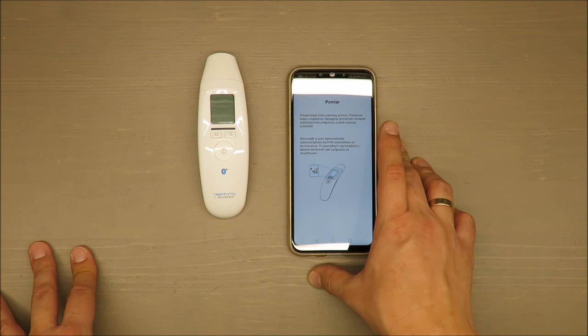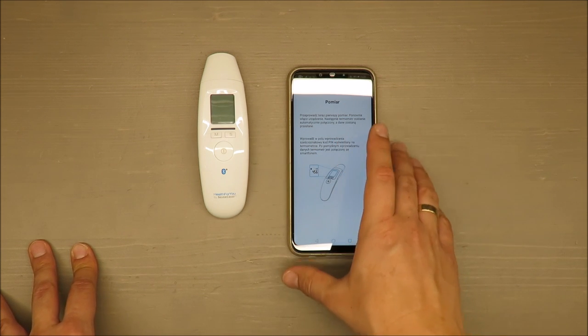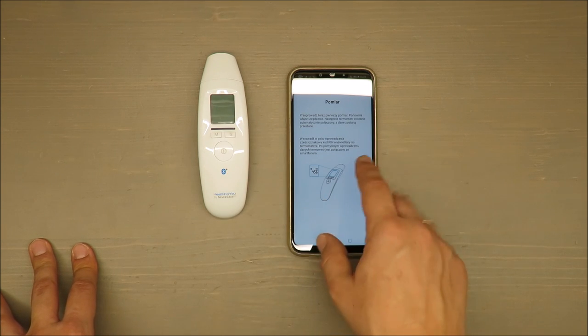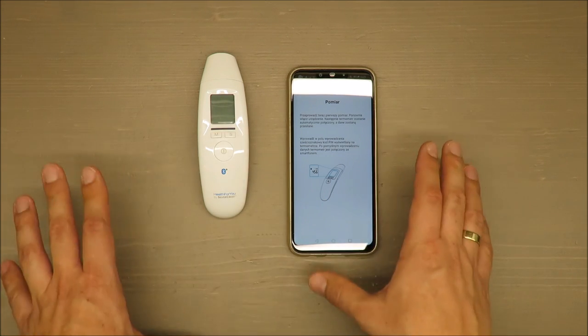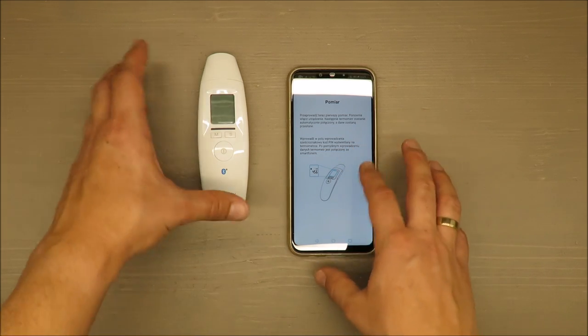The application is showing what you should do at each step. Then you're clicking next, and it's written that you should make a measurement and it will show a pin code that you have to enter to the smartphone, and it should be ready.